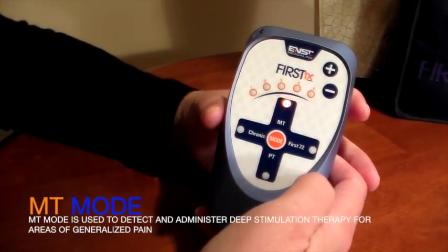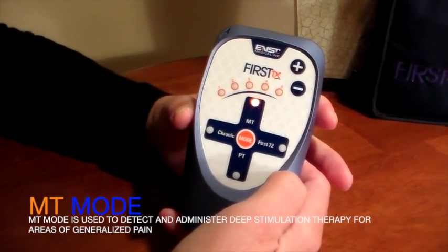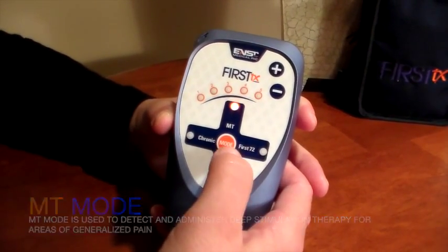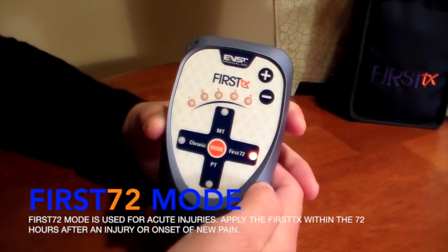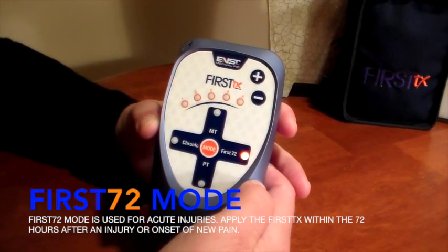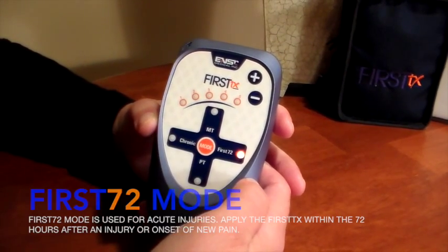In this segment, I'm going to be referring to the extended guide where we learn about the four different modes of treatment and when and how we use them. Let's start with MT mode, which stands for Massage Therapy. This mode is used to detect and administer the deep stimulation therapy for areas of generalized pain. Press mode to toggle over to the next function, which is First 72. This is used for acute injuries such as an ankle sprain. You want to apply the device within the first 72 hours after an injury or onset of new pain.